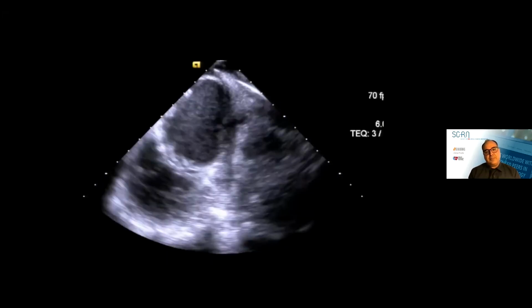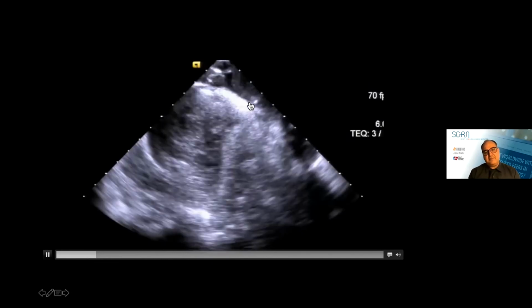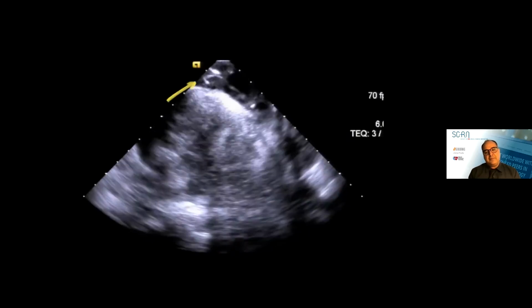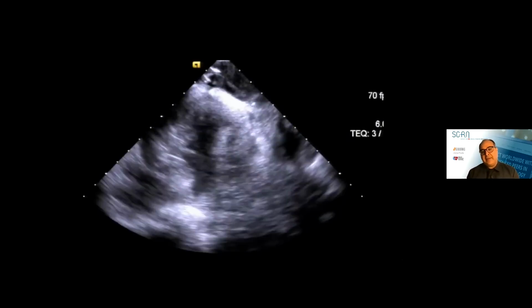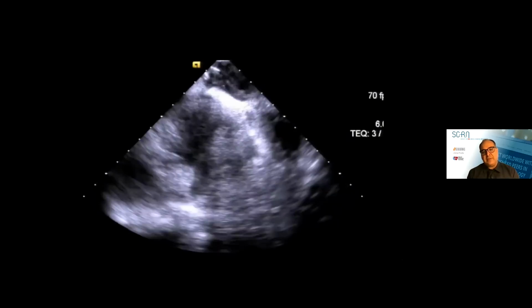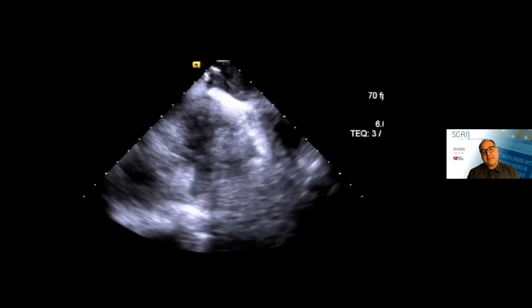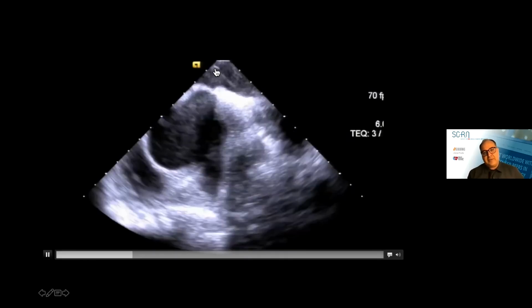As the sheath goes up, you rotate the catheter. This is the sheath. You can see it sitting in the SVC. And we'll take the wire out and flush the sheath. Of note, I will give 10,000 units of heparin right off the bat as we get the short sheath in the groin, because a lot of times clot is formed on the wires, and you certainly don't want to take them to the left atrium.